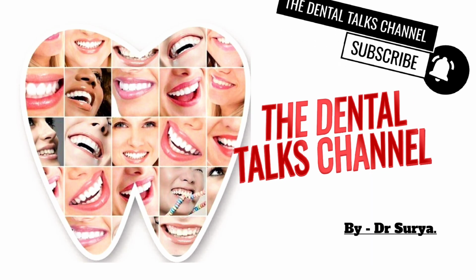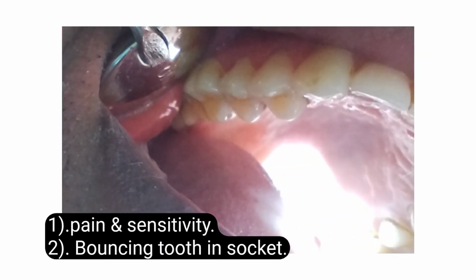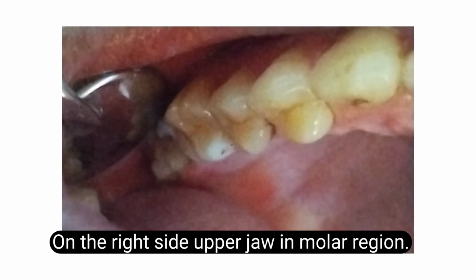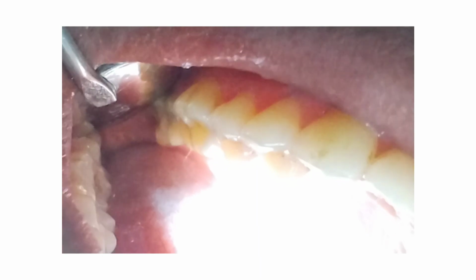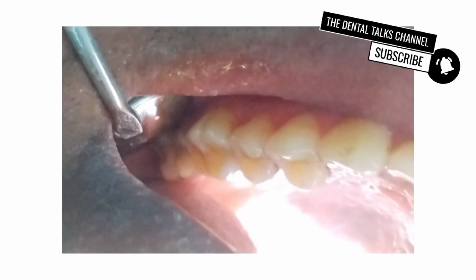Let's start our video. Today a patient of about 40 years came to our clinic with a complaint of a mobile tooth in the socket, severe pain and sensitivity, along with swollen gums. On examination, we found it was not a normal tooth in structure and position, as it should be in the molar region. On further examination, we found it to be a tooth condition called paramolar.